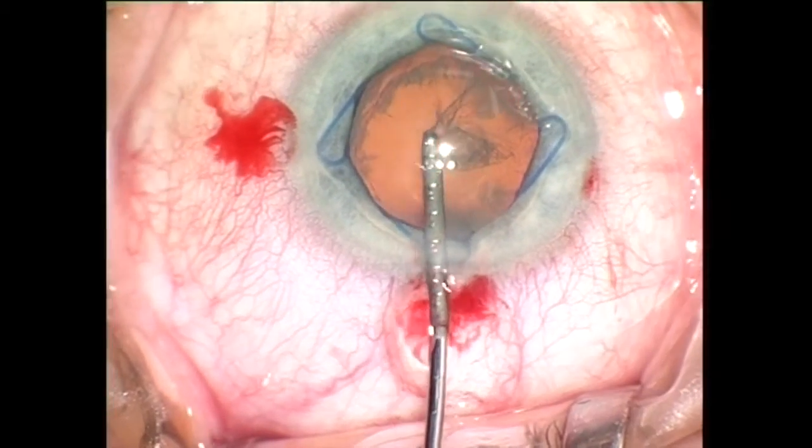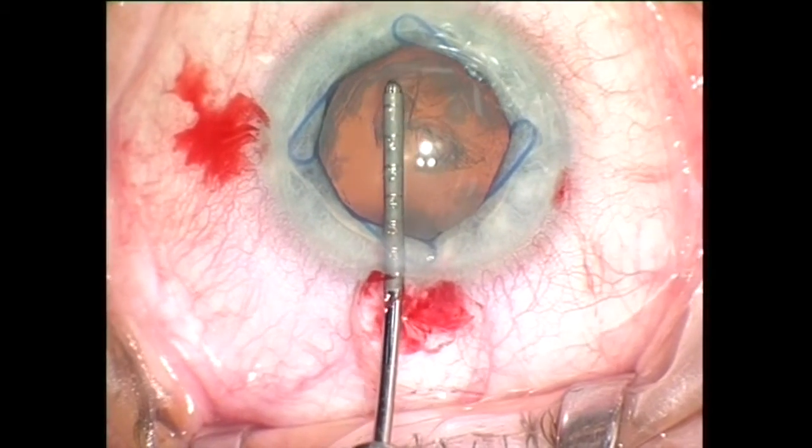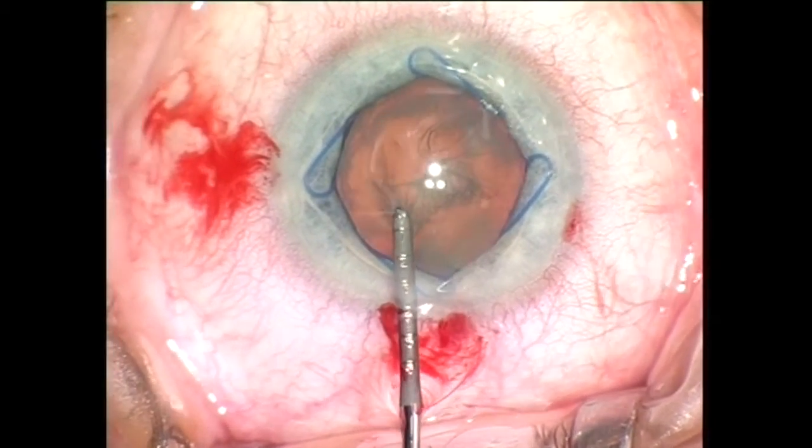Now I'm using capsulorhexis forceps to create a circular opening in the anterior capsule. The very smooth mechanism of this instrument allows me to precisely control the capsular flap.